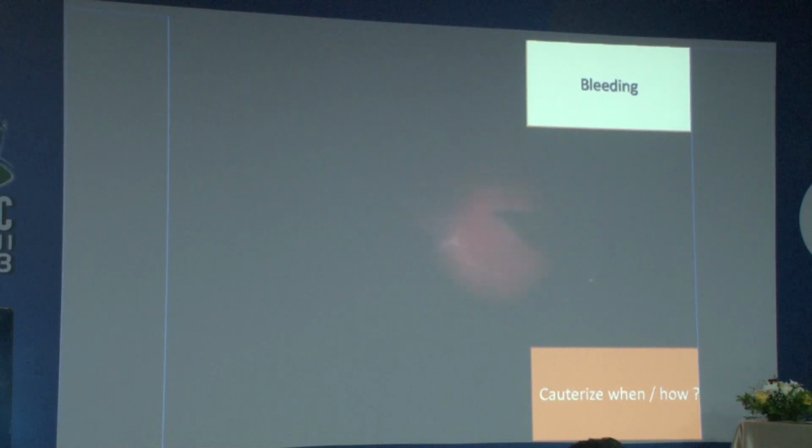I could see there was some detachment on the nasal side. As you can see, the attachment is only in the peripapillary area, and anterior to it there is no PVD at all. So I am trying to truncate and then induce the PVD further. But in this case, at that point of time, again, I was an aggressive surgeon. I didn't think of giving an anti-VEGF before the surgery, and as we can see, most of the time the surgical view is occluded by hemorrhages, so I thought I should just cauterize whatever is important. As minimal cautery as possible, and as good as it can be.